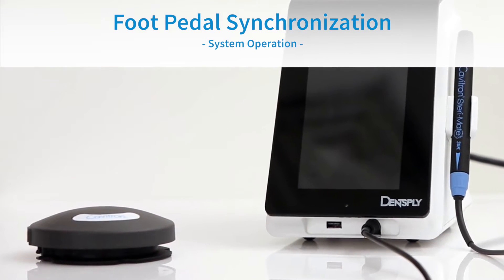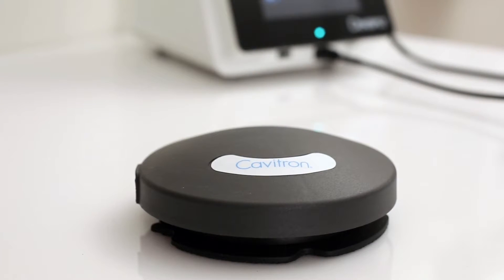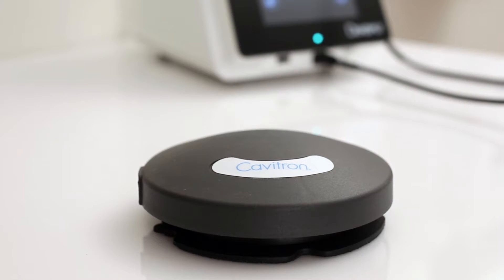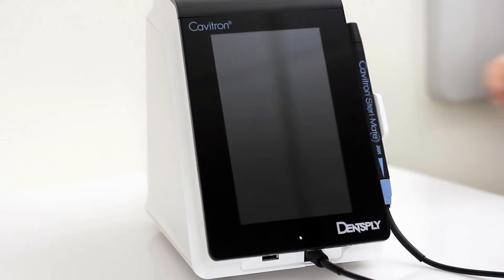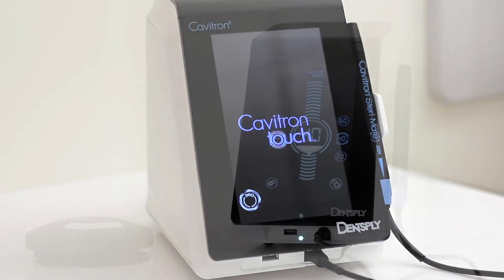Tap-on foot pedal synchronization: The tap-on wireless rechargeable foot pedal supplied with your system has been factory synchronized with the base unit. Should a replacement foot pedal be necessary, synchronization will be required prior to system operation. Users should maintain a distance of no more than 10 feet between the base unit and tap-on foot pedal during the synchronization process. To synchronize the foot pedal, begin by turning on the main power switch located at the rear of the system to the on position. The main screen will appear.